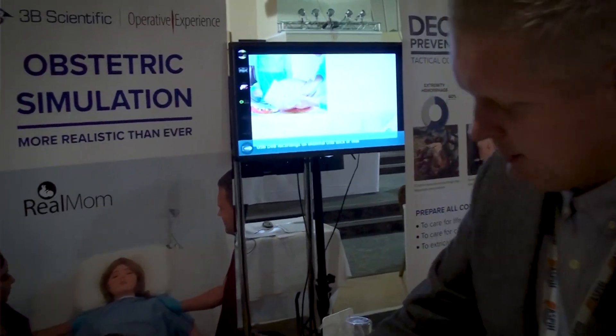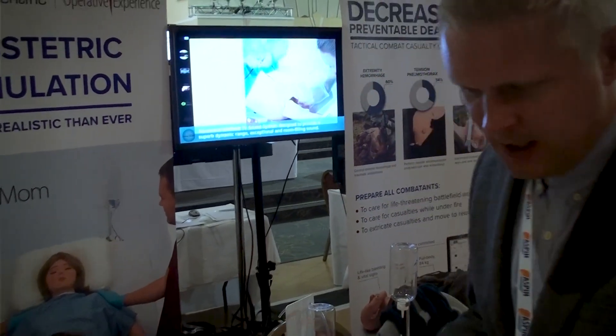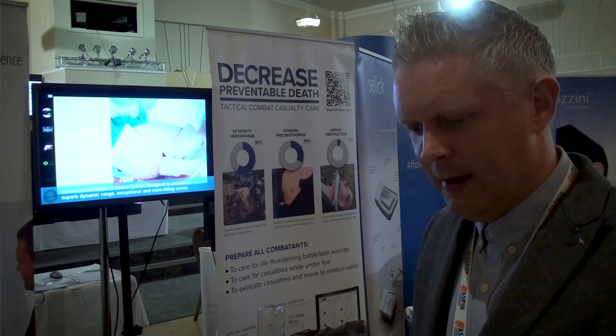It can be loaded in different ways: you can have the umbilical cord wrap, it can be transverse, back to back, breech birth — whichever way you want to load it up.